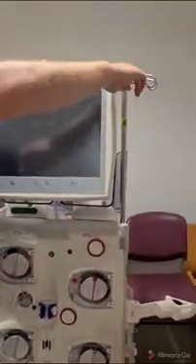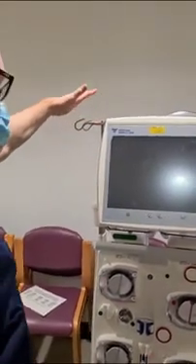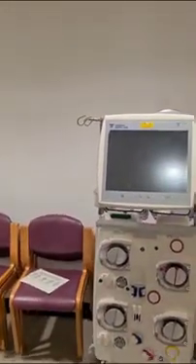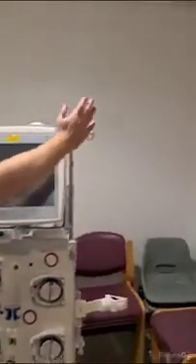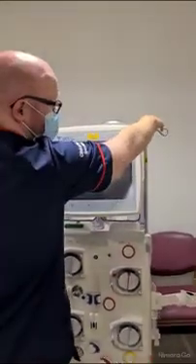Top here we have our drip stands. So if you're facing the machine, on your left hand side this is where we're hanging our citrate and calcium — citrate on the left. And then on the right hand side, this is where we hang our one litre bag of saline and our collection bag.